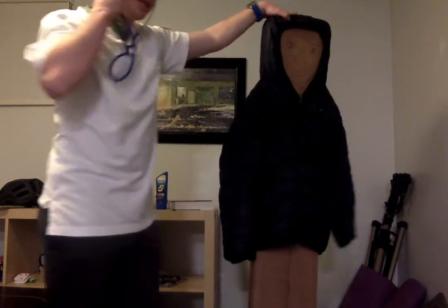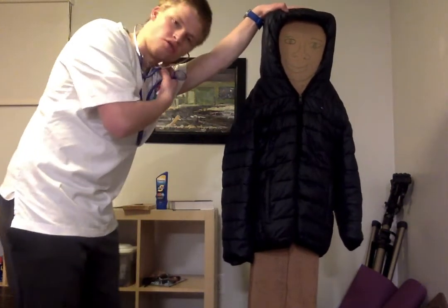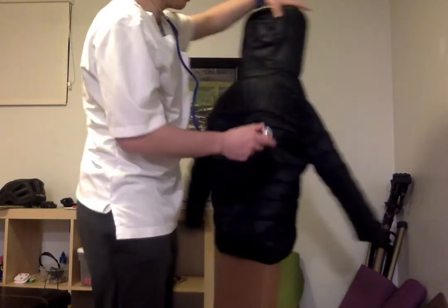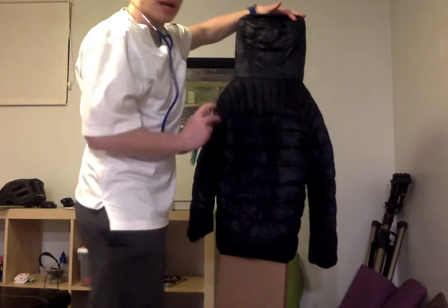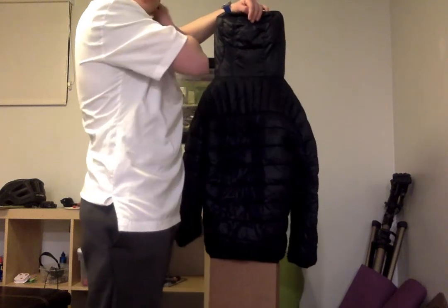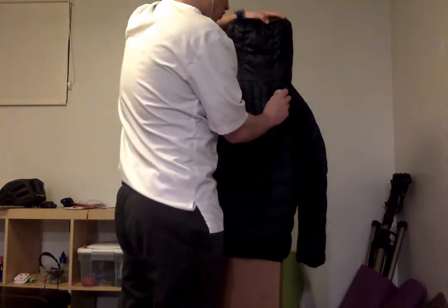All right, no wheezing, no sounds of edema, so no rustling, rattling. This would be more like crackling. Now I've turned my guy over, and I'm going to listen to him as if there's a strap on him. So we're going to do 4 on each side.